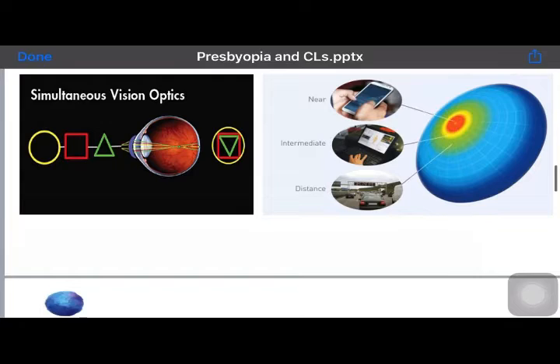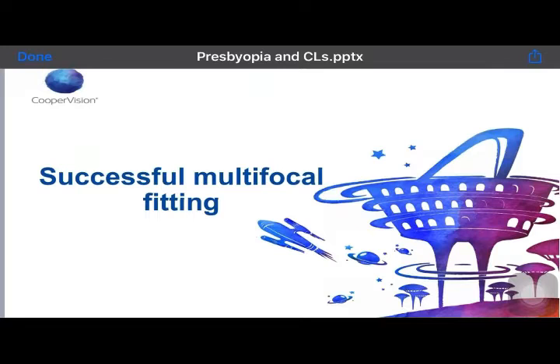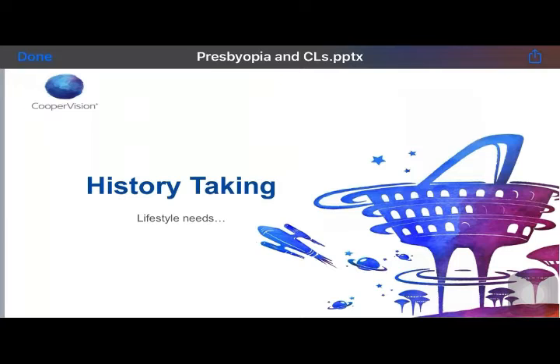Now, how to fit successful multifocal lenses in your patient's eyes? Well, it starts with taking a history. Multifocal contact lenses will always be successful if you know how to take a proper history of the patient. Now, this is different from the history we usually take in optometry. What we do is we ask, what is the problem with your vision? Are you hypertensive? Are you diabetic? Do you have a family history of hypertension or diabetes?